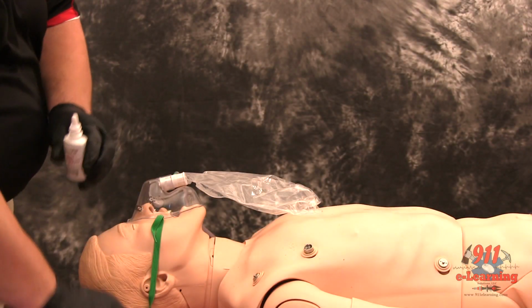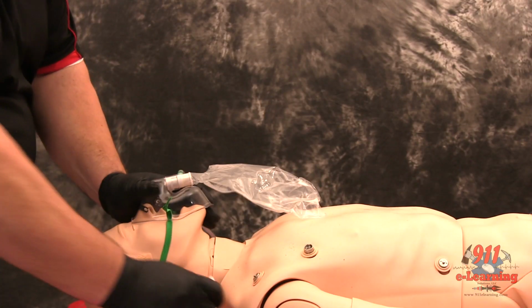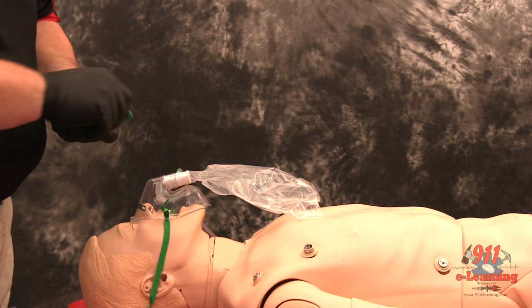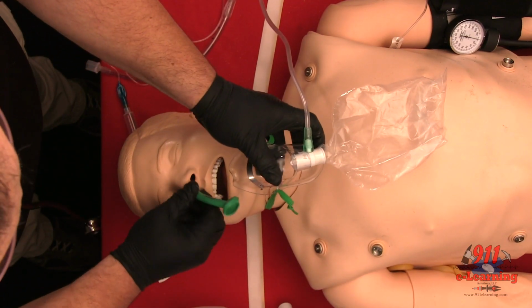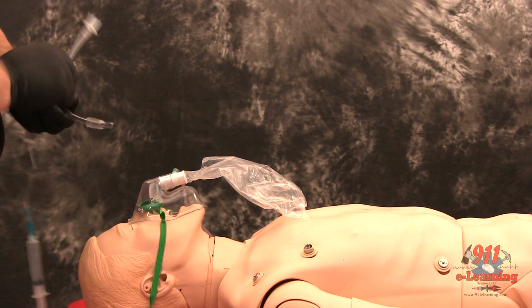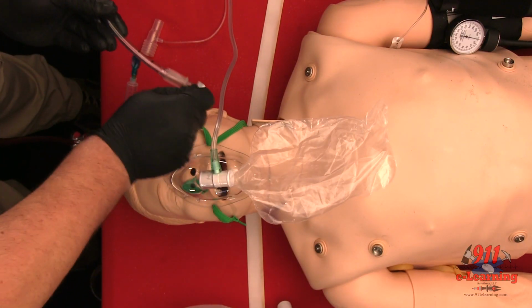If available, premedication with a nasal decongestant spray will help reduce the incidence of bleeding. Select the largest and least obstructed nostril and insert a lubricated nasal airway to help dilate the nasal passage. Pre-oxygenate the patient. Lubricate the tube. The use of a BAM device is recommended.